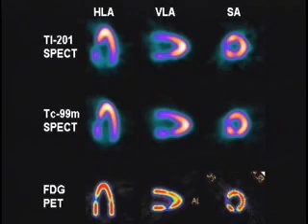So this is part of a very classic bread and butter cardiology stress test, the nuclear stress images. Are we looking here at, no, these are false color images based on heat, or what are we looking at? Well, you can program into the computer however what percent uptake you want represented by what color. Okay. So this shows up well on screen, so it's often used.